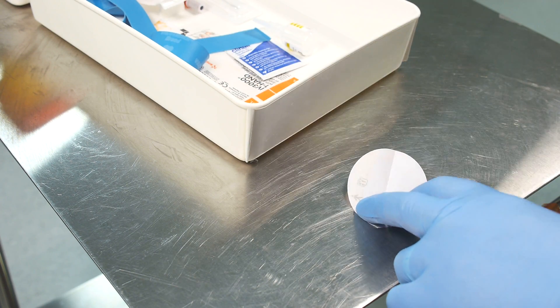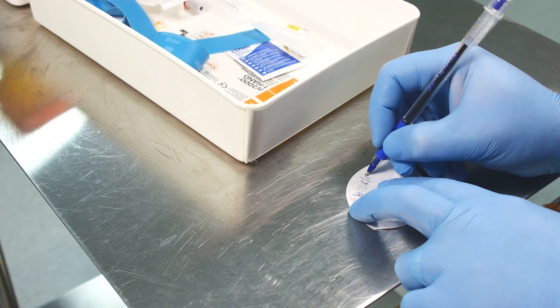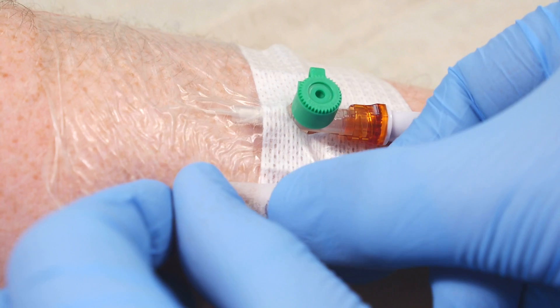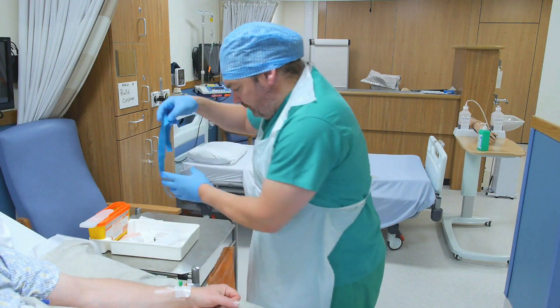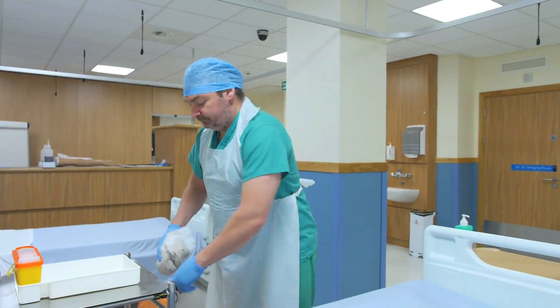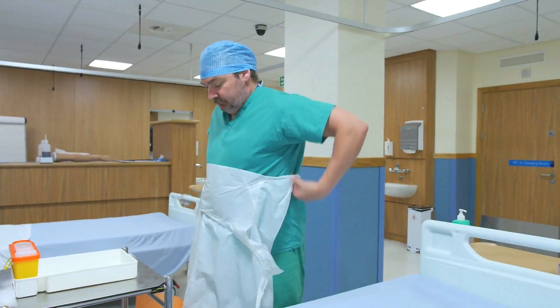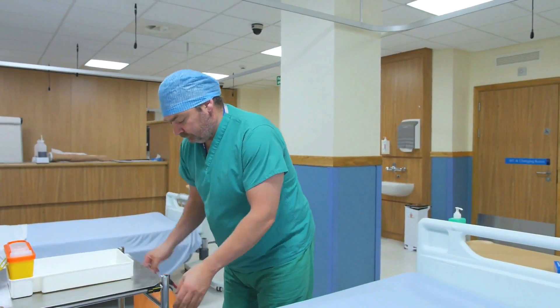Remember to date and sign the supplied annotation strip and don't obscure the insertion site. Dispose of clinical waste and dispose of your PPE — gloves, followed by apron. It's important to instruct the patient to report any swelling, redness or pain.